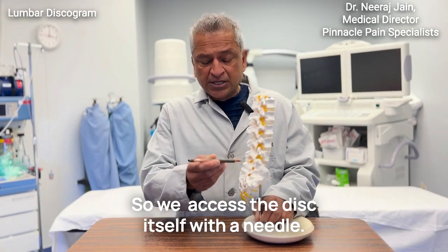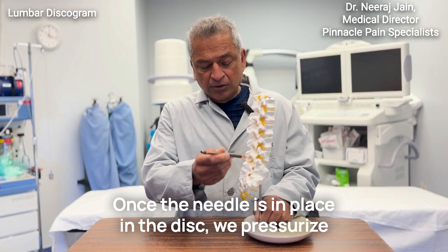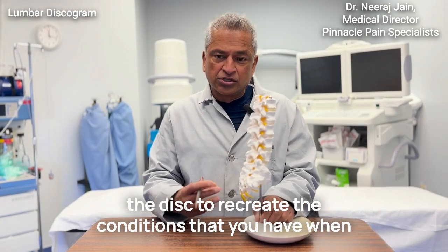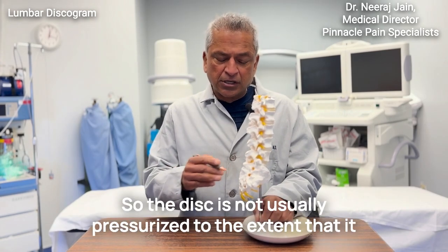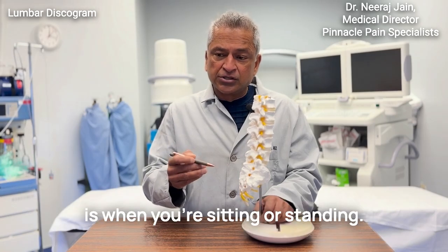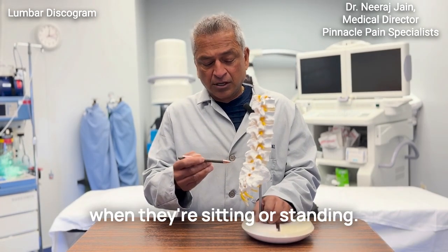So we access the disc itself with a needle. Once the needle is in place in the disc, we pressurize the disc to recreate the conditions that you have when you're sitting or standing. When you're laying, you have the lowest pressure, just like a tire, in the disc. So the disc is not usually pressurized to the extent that it is when you're sitting or standing. People don't have pain as much when they're laying as they do when they're sitting or standing.